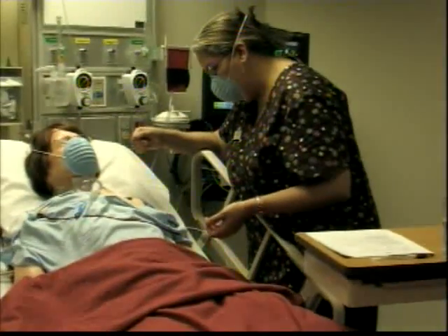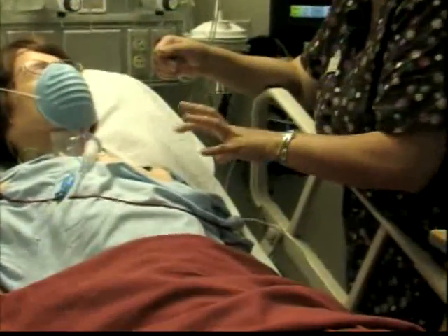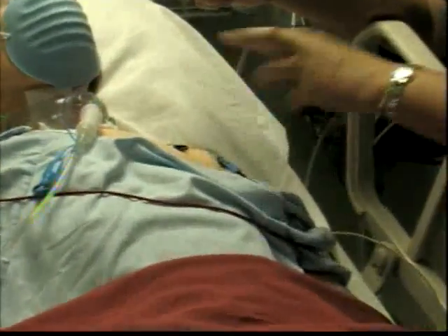And you're going to do another inspection, because at the beginning you just kind of felt around it. You didn't actually look at the site. Now, with the dressing off, you can take a look at the site, look at the sutures, and you can look for any signs and symptoms of infiltration or phlebitis. Okay, so now we're going to come over here. We're going to prepare our kit.